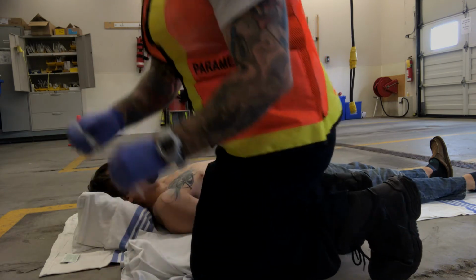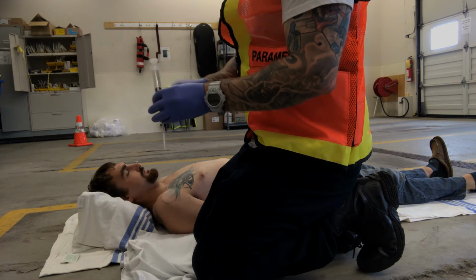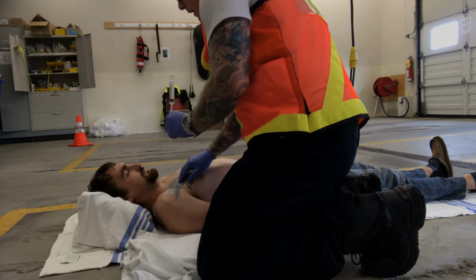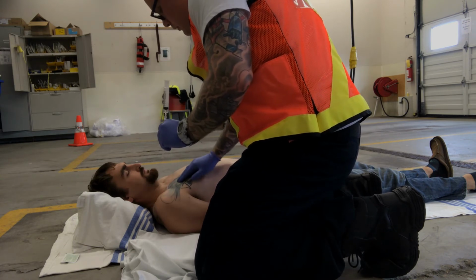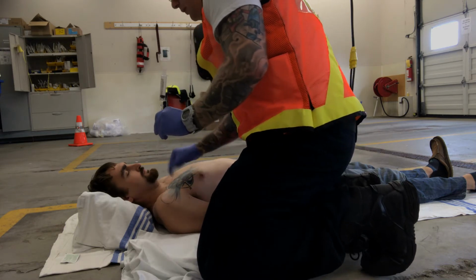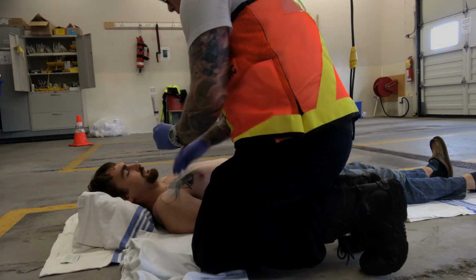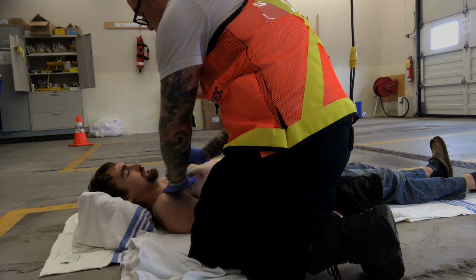I prepared my decompression needle with 2 cc's of normal saline attached to the catheter. I have my landmark space. I'm going to go above the 3rd rib, making sure not to go underneath the rib and cause arterial or venous damage. So above the 3rd rib, I'm going to go in perpendicular, straight down.